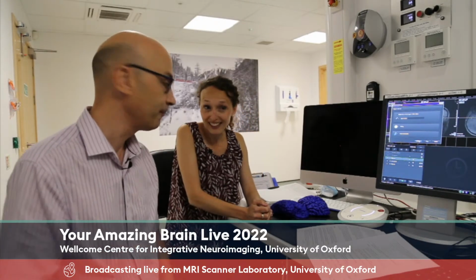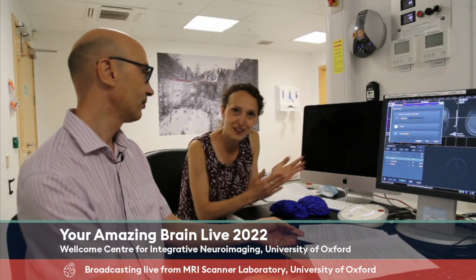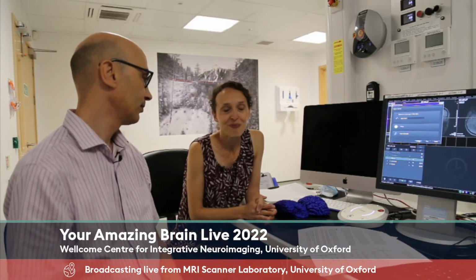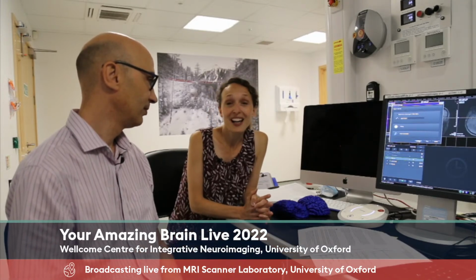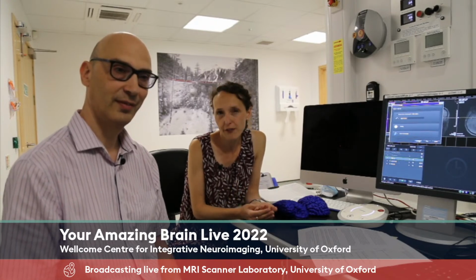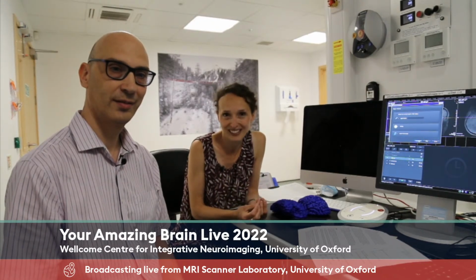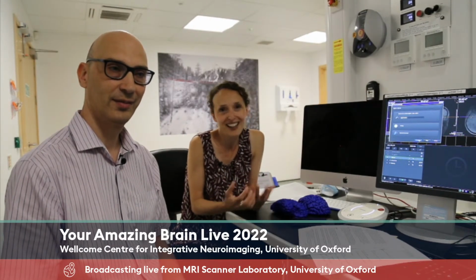So Miriam, how have we put this together to make an actual experiment from that? We have a participant lying in the scanner right now for us. Her name is Barbara. You'll get to see Barbara in a moment. We talked to her and asked what sort of thing would make her feel afraid. And Barbara really doesn't like the animal octopus. She just doesn't like looking at octopuses or thinking about them, and it makes her really anxious and afraid.